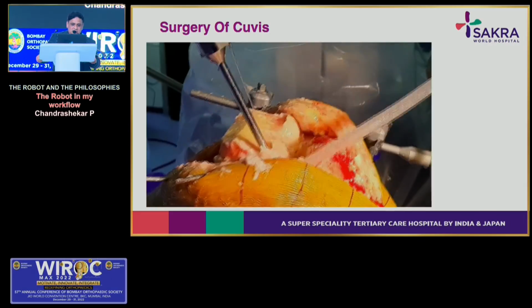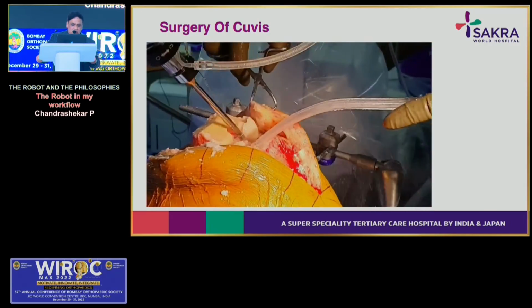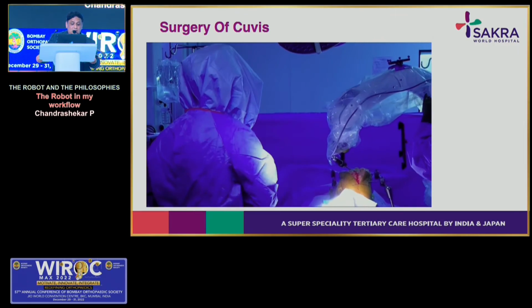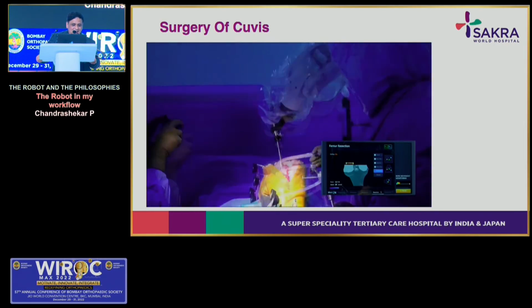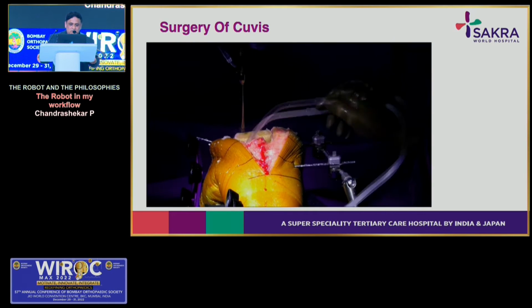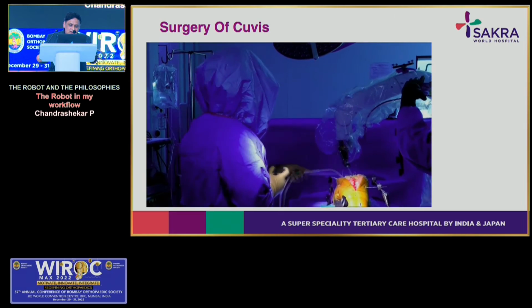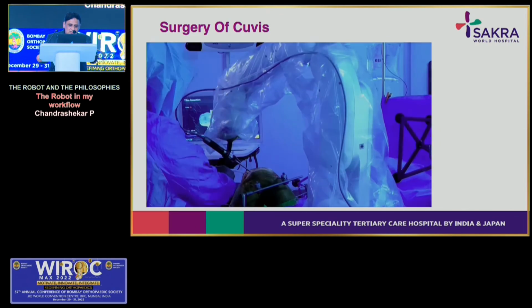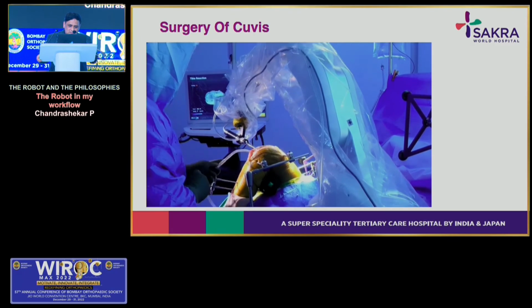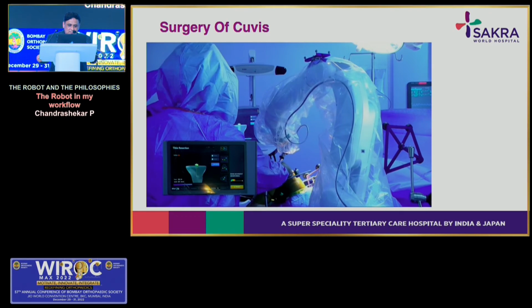If you want to do measured resection, you can do. If you want to do functional alignment, keeping the tibia in varus, all this is up to you. Intraoperatively, you don't have to follow the rigid pre-op plan. It gives all the options to change as per the soft tissue requirement. Once the robot does all the milling, the surgeon puts the trial implant, then again sees how the ligament looks, how the soft tissue balancing looks from flexion to extension. Then he proceeds with the final implantation.